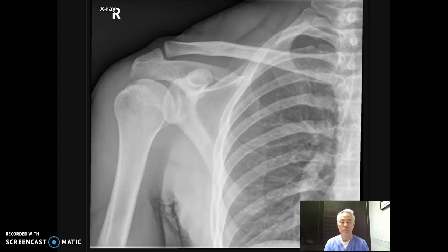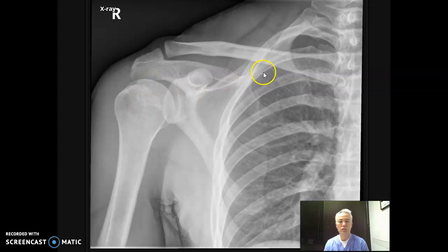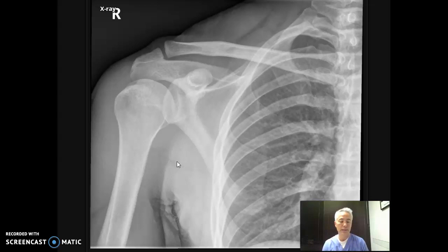The first view we're looking at is an AP shoulder in neutral rotation of the humeral head. On our AP shoulder we want to see three things: we want to see our clavicle, our scapula, and the head of the humerus. The shoulder girdle is made up of the clavicle and the scapula, but the shoulder is actually made up of this third portion, which is the head of the humerus. You're going to use a 10 by 12 cassette in transverse — so it needs to go side to side.